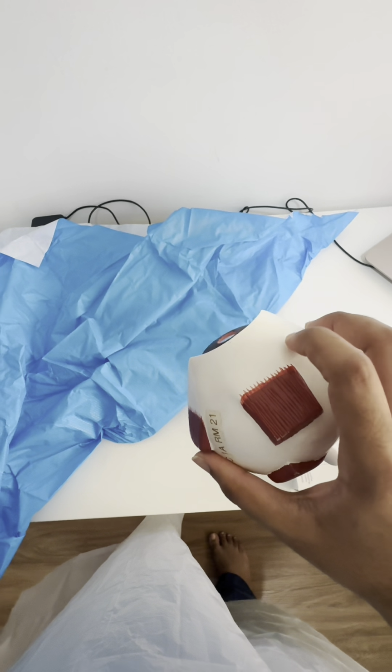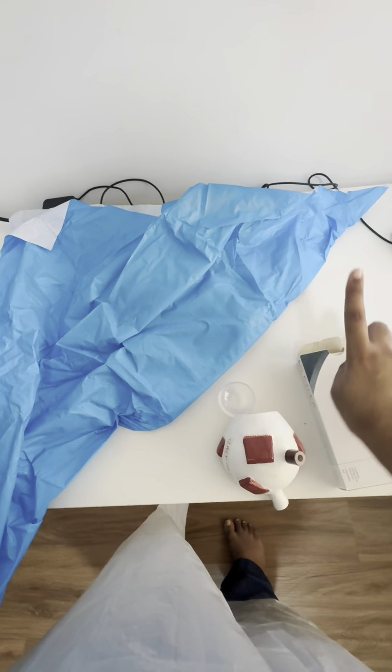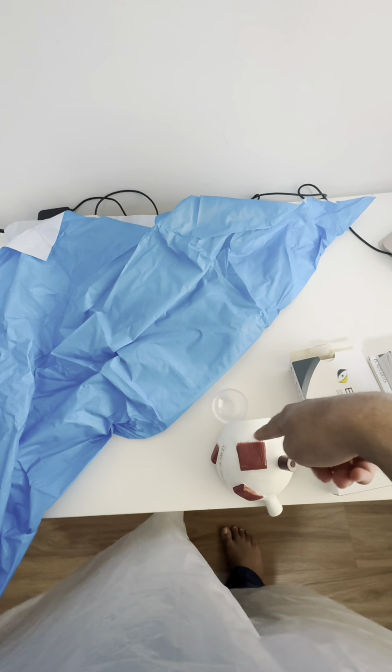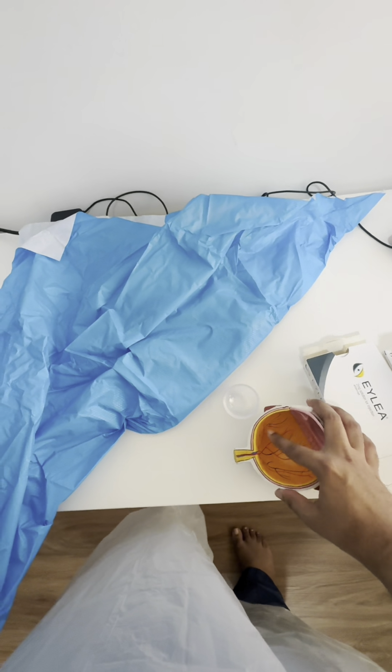The most important thing is you have to give the patient a target, maybe a figure to look at. You just tell the patient, okay, look in this direction, focus on one direction so that the doctor can do the injection. If not, the patient will keep moving up and down. Once injected, the medication will go into the vitreous body.